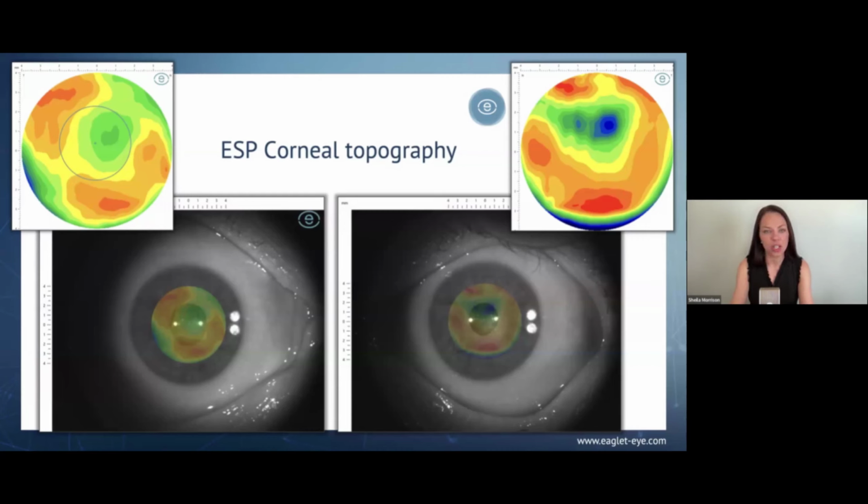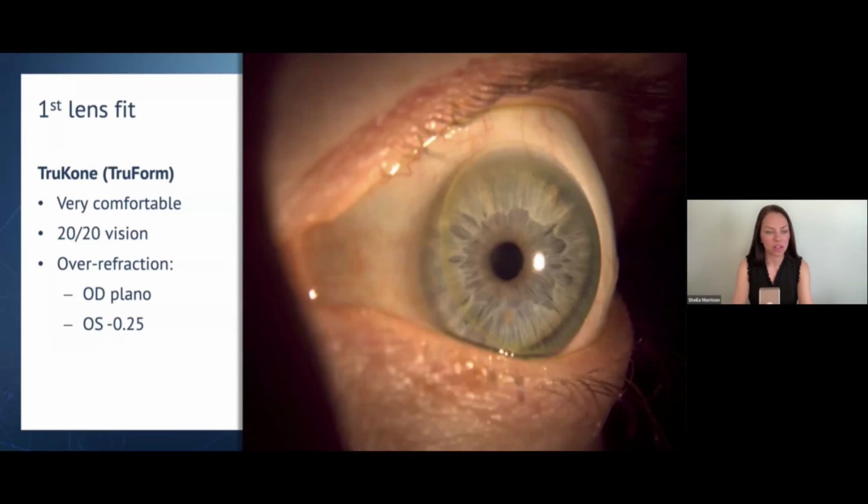And I wanted to share, again, same process, utilizing an algorithm to design empirically. Here's a case that was successful on the first fit, comfortable with his lens, very little time spent on my end so that I could dig in a little bit more into how we can now apply the multifocal optic that you want. Make sure that we're watching for complications and things like that.